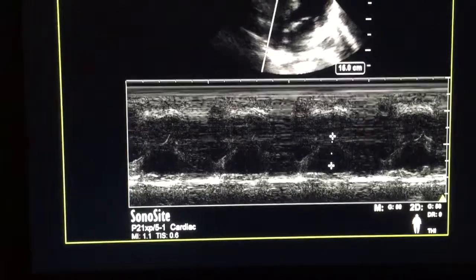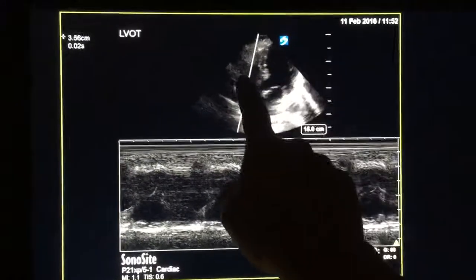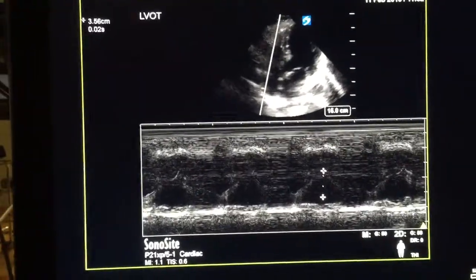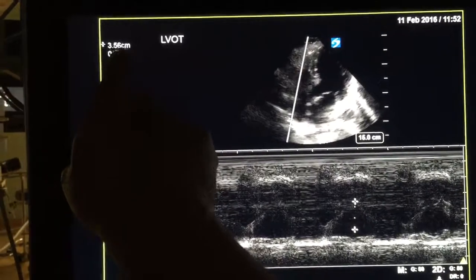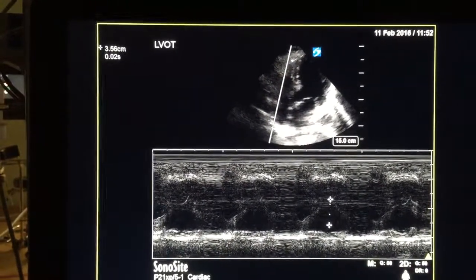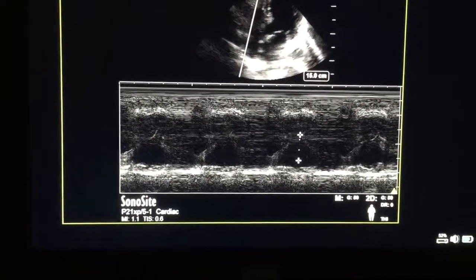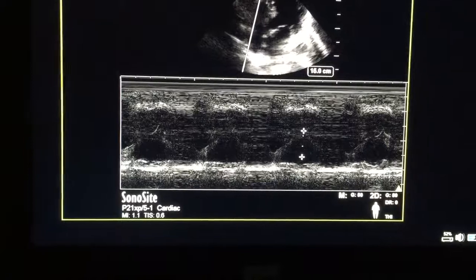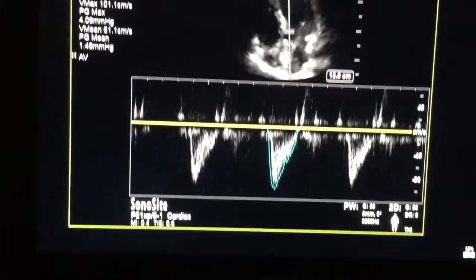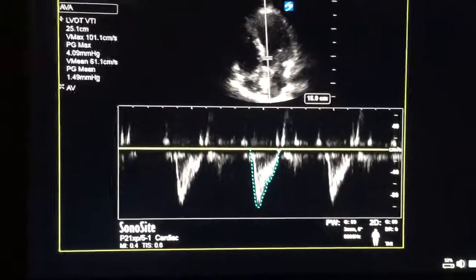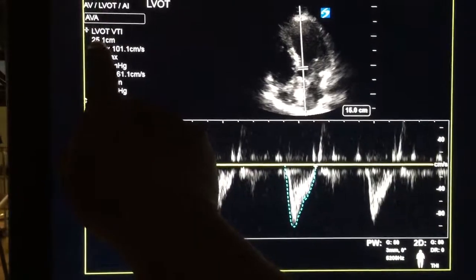This is the right ventricular function — they call it TAPSE. This is the left side, this is the right side, this is the tricuspid valve. Here it is very clear, the value is 3.56. Now, apart from this, what he has done is LVOT estimation of flow. LVOT VTI is 25.1.